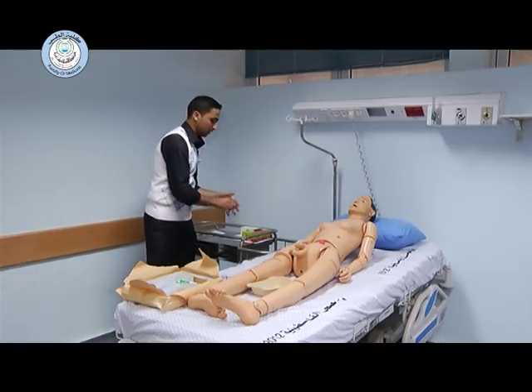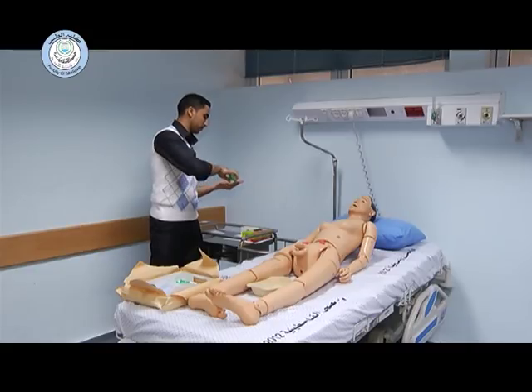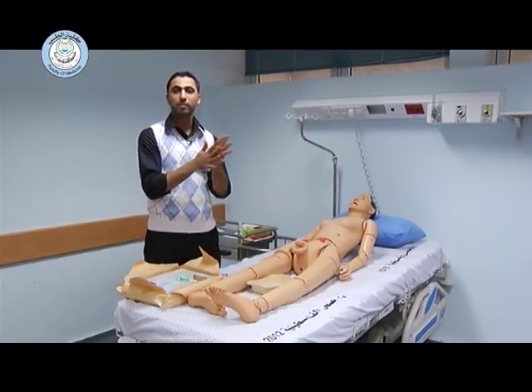You can wash your hands using the alcohol hand hygiene. We can wash our hands using the six-step technique: palm to palm, five times.